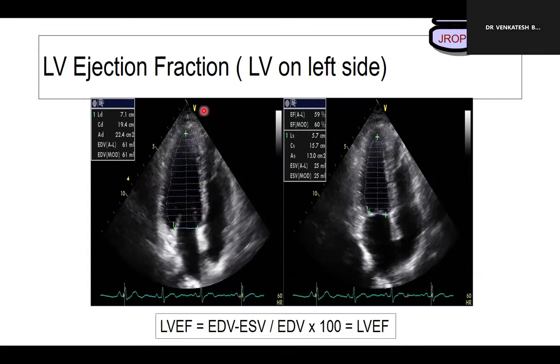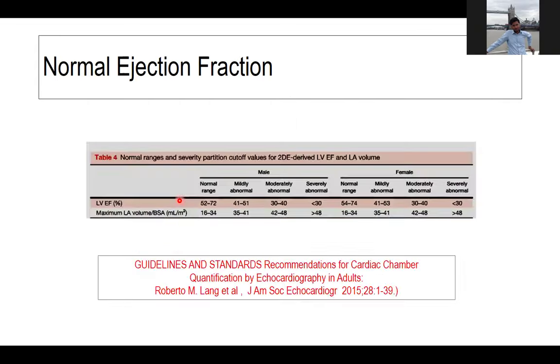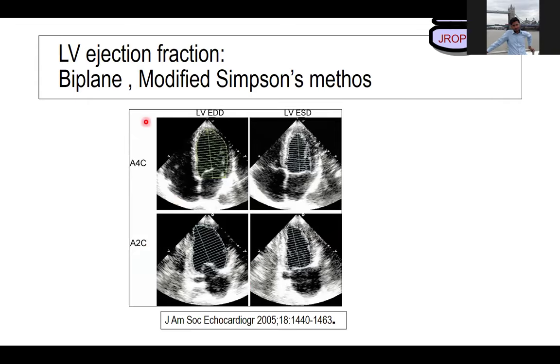Yes, sir. So my quest would be, this is Mayo classical teaching. Not many people have learned from Mayo. So we always say that we keep it only on the right hand side. My LV would always be on this side, RV on this side. Yes, sir. Thank you, sir. Confusion clear. Like this way.